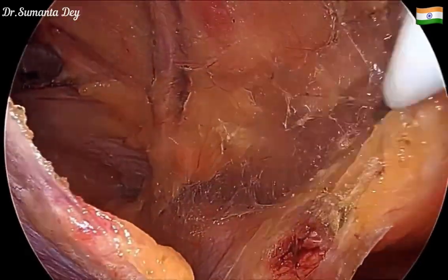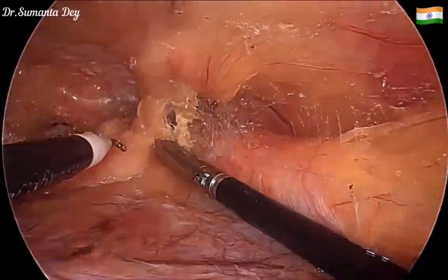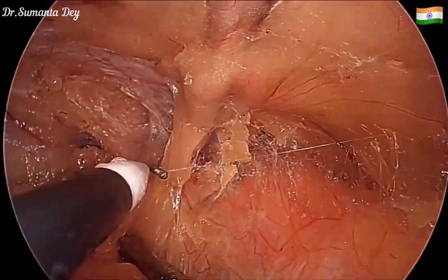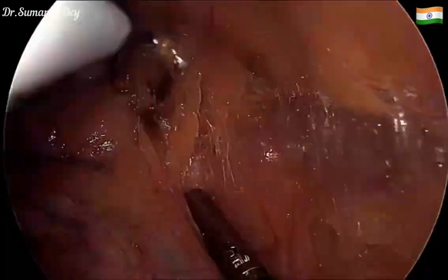A little further dissection is required lower down, so I changed my instrument and used my left hand to create a little more preperitoneal plane inferiorly, safeguarding the inferior epigastric vessel by staying just below it.